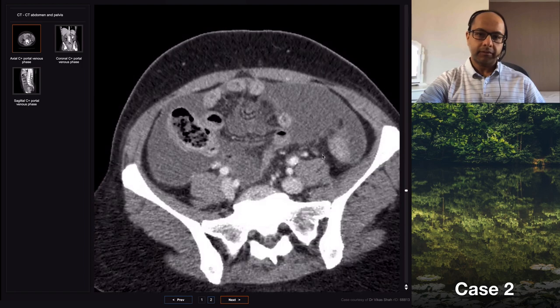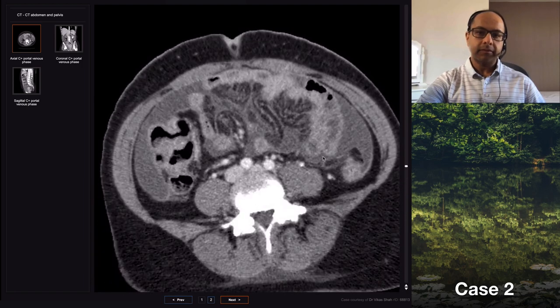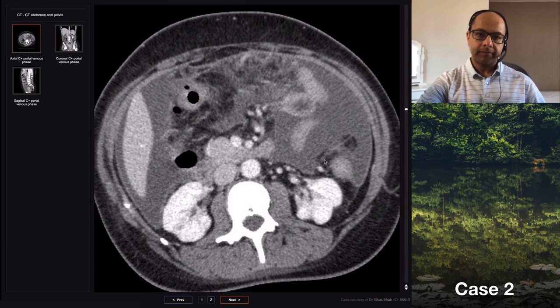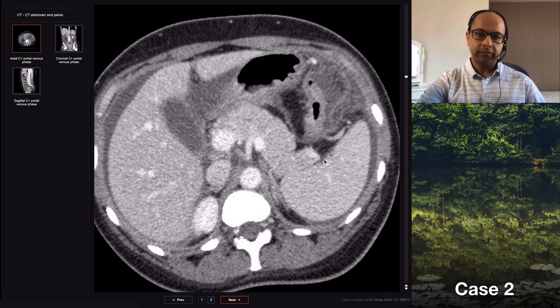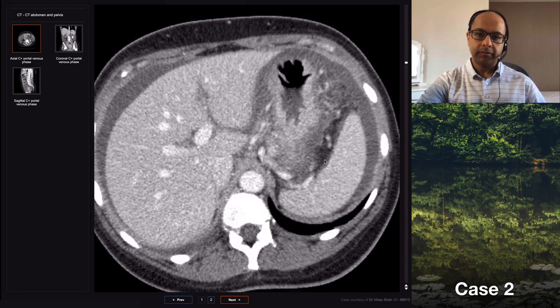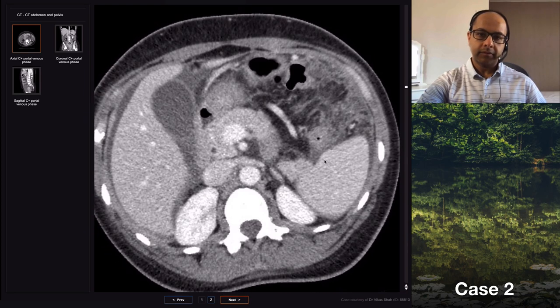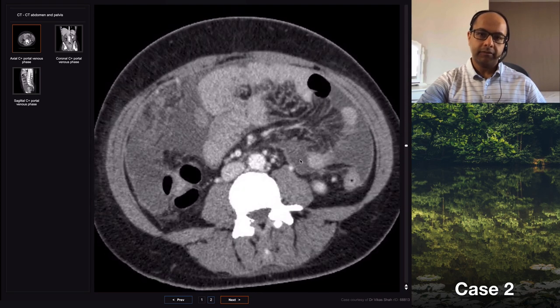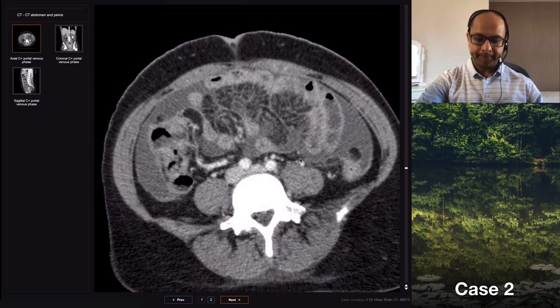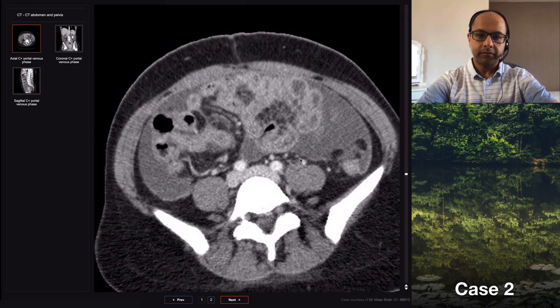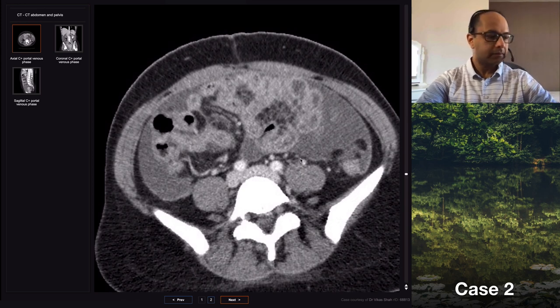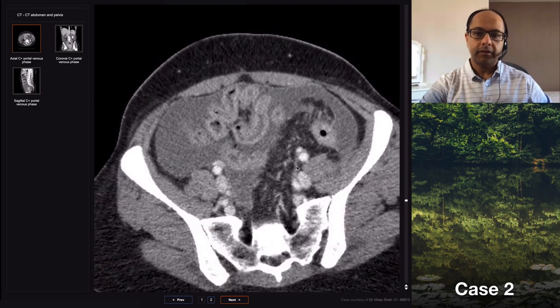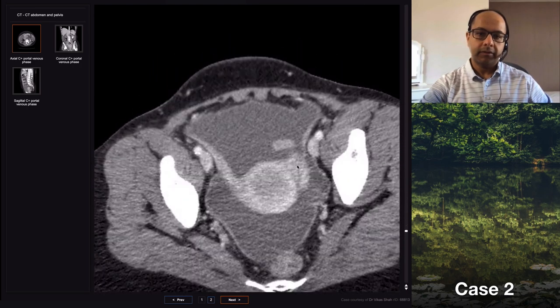Overall, the features are consistent with peritoneal carcinomatosis and there is suspicion of a left adnexal mass. I don't see bowel obstruction, though the small bowel loops in the upper abdomen seem displaced. I would recommend referral to the gynecology MDT, an MRI of the pelvis, and possibly a biopsy from the omentum.